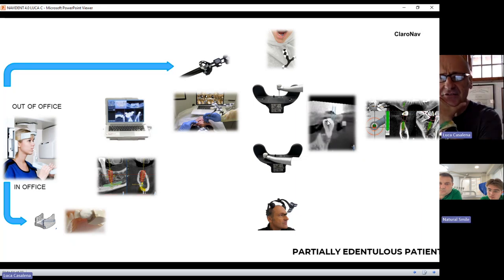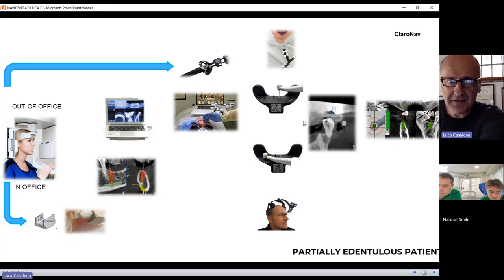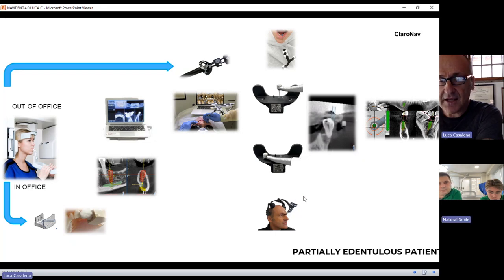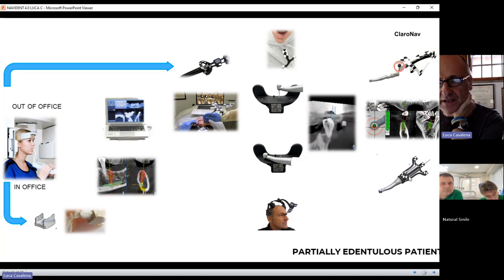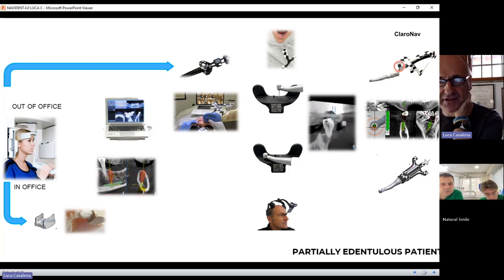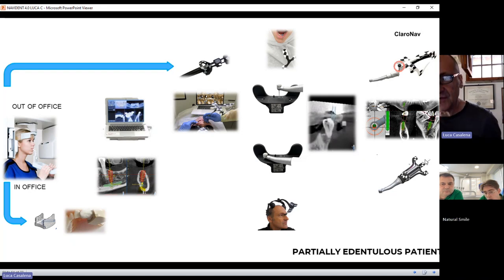There is another equally important concept: optical targets, which are necessary for dynamic navigation. You have an optical target for the patient and one for your contreangle. You must have both — you cannot have one without the other. You should have an optical target on the patient and an optical target on the contreangle or any surgical tool you're going to use.